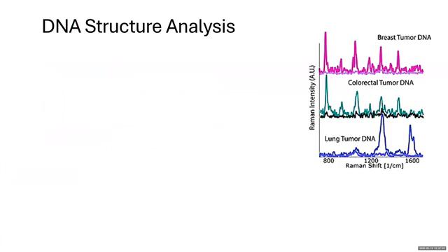different biomarkers which we use in liquid biopsy. One hallmark of cancer is the aberrant changes in the DNA structure, so I wanted to use the structure of DNA as one of my biomarkers. To detect circulating DNA at an early stage, we are using these ultrasensitive sensors. This sensor can detect up to femtomolar concentration of DNA.